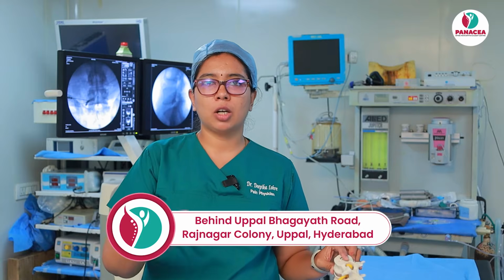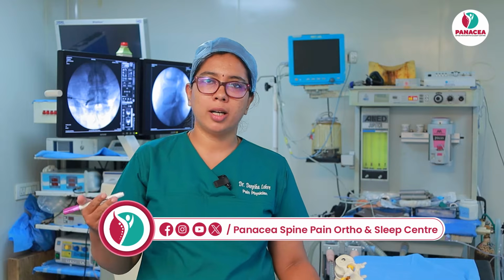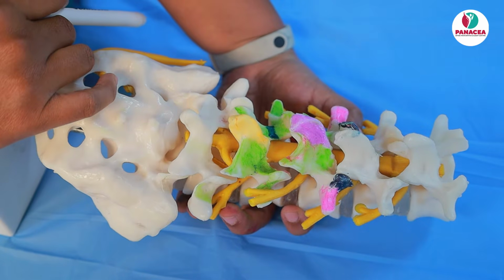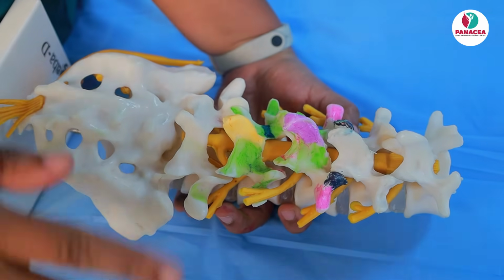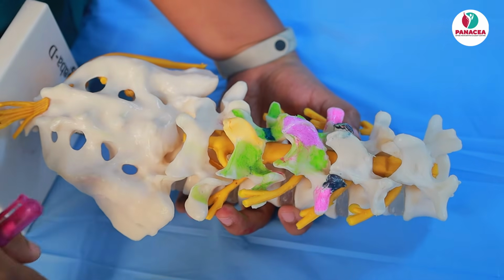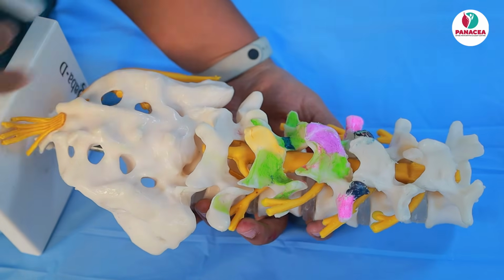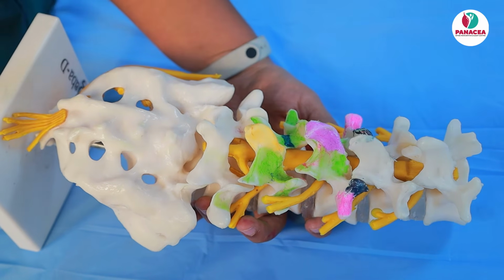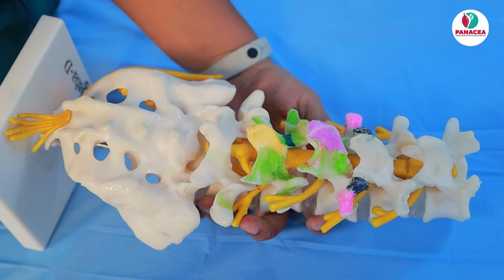First let me start off with the anatomy, and then we will proceed to the indications, contraindications, complications, and then the procedure and how it is done. So let's start with the anatomy. Always, as a pain physician or anyone approaching the spine, you should be very well versed in spinal anatomy. Let me explain on this model, and I will show you the lateral view so that you will be able to appreciate the fluoroanatomy also.